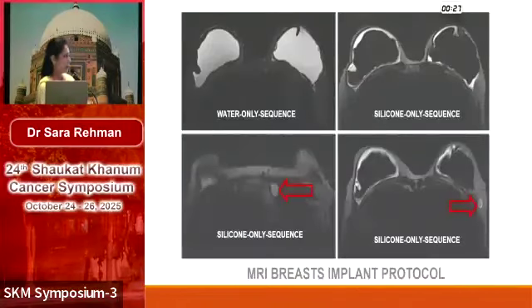Afterwards, she also had an MRI scan to assess for any associated soft tissue. These are the implant protocol images that show bilateral double lumen expander implants with adequate inflation of the inner saline lumen. There is no extracapsular rupture or associated mass in this patient. This is the site of clinical concern on the left lateral chest wall, and a similar nodule was seen in the right internal mammary region. These nodules follow the signal of silicone on the silicone sequence and are suggestive of silicone adenopathy secondary to silicone gel bleed in this case, and there is no implant rupture.